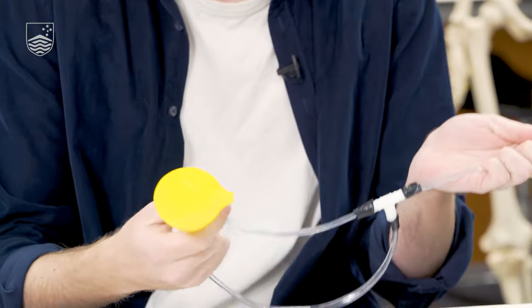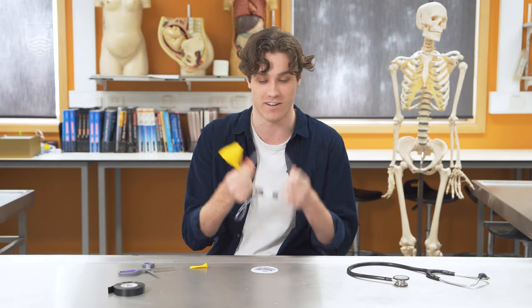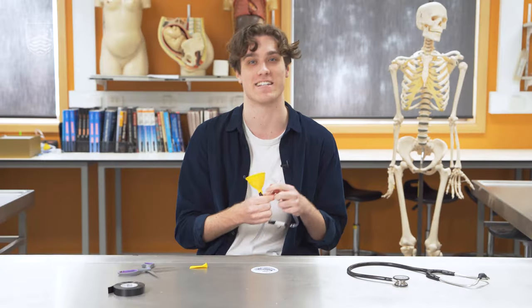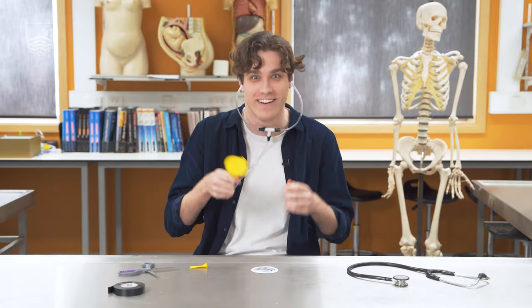So now we've finished making our stethoscope. We've got our ear pieces and they can go in your ears, the end which is the diaphragm, and then you can hold that up to your heart and listen to inside your chest. Give it a go.